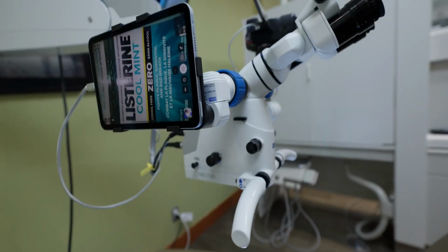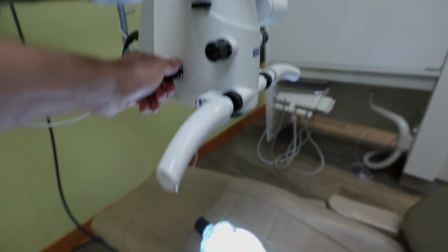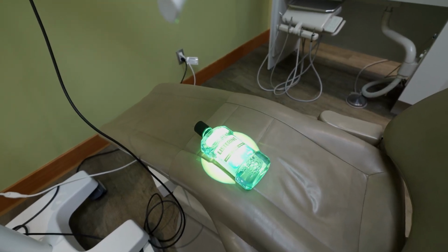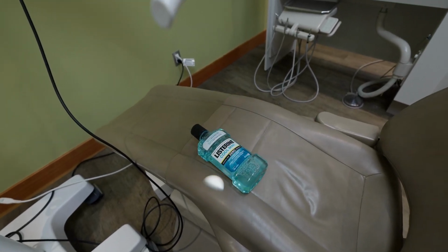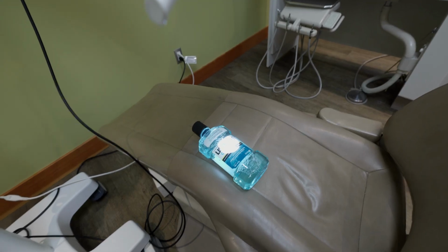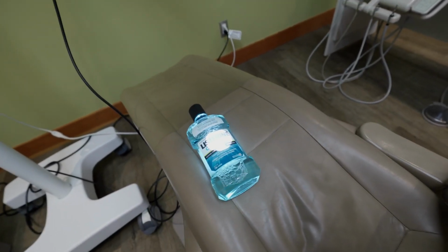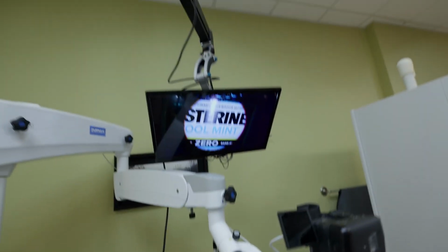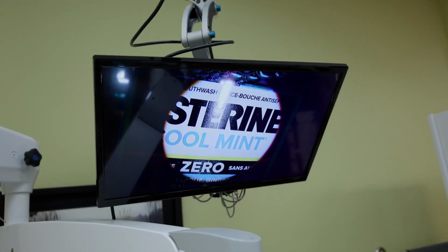A couple other things about it. They've got a little different filters here. There's your curing filter. This is supposed to be a surgery filter. And then you've got these two little spots which narrow the light diameter down. This is super helpful if you're working in the anterior. So for example, that's all you see in terms of light.